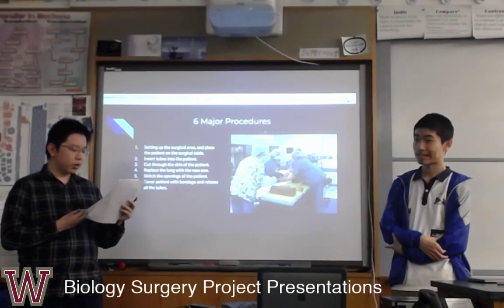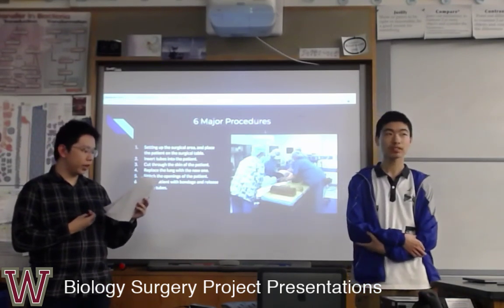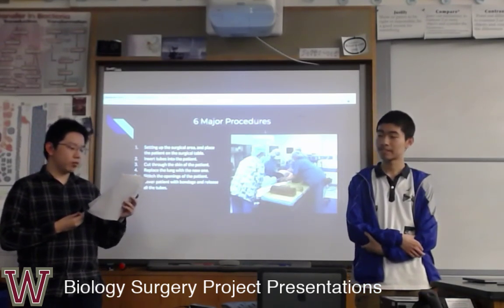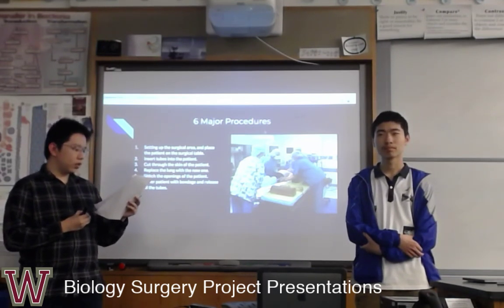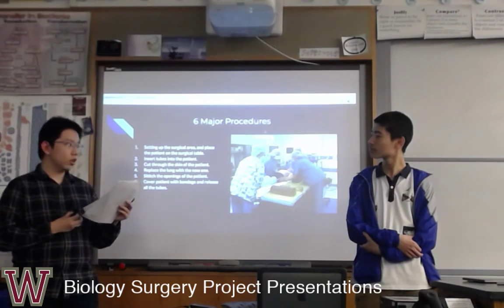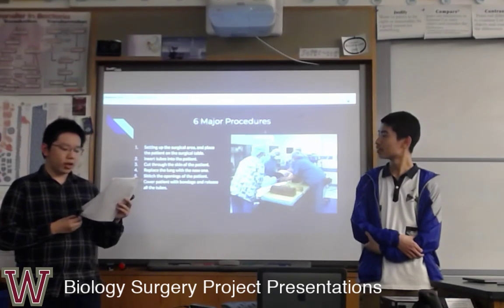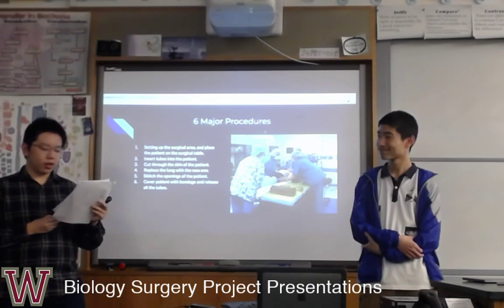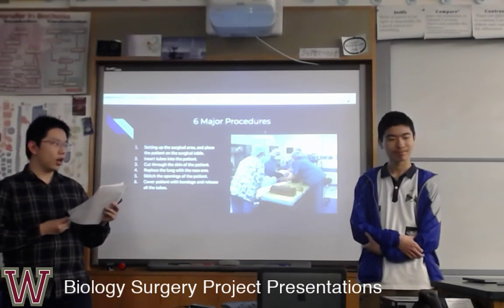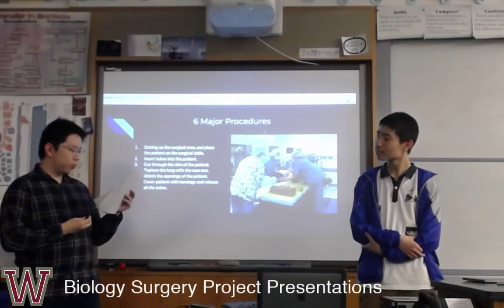We can place a retractor between the skins to hold the opening places to make it much more convenient to do the surgery. Now the ribs are all exposed to the central area. We can use a scalpel to divide the pulmonary vessels first, then divide the bronchus. We should carefully take the left side lung out and prepare the donor's lung, and put the donor's lung in to replace the patient's lung.